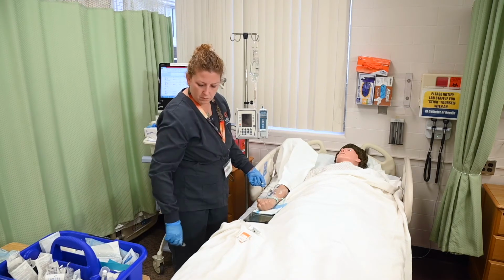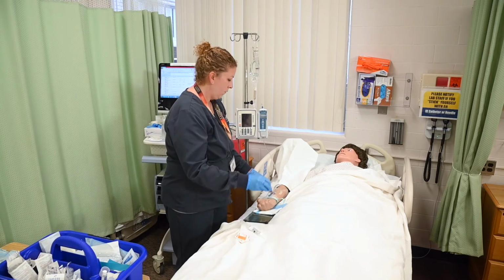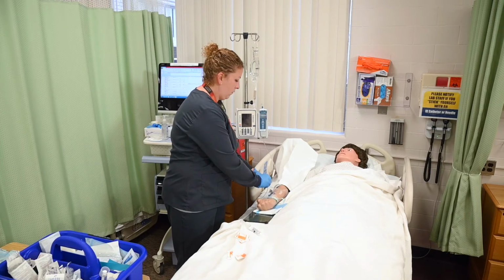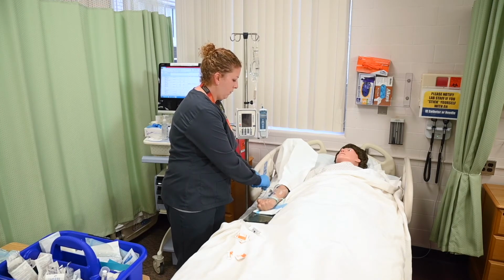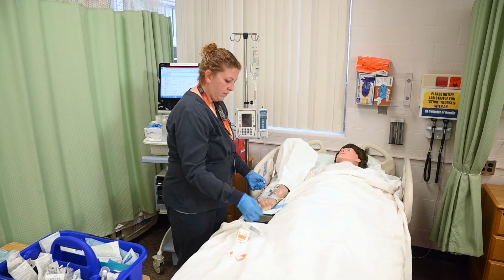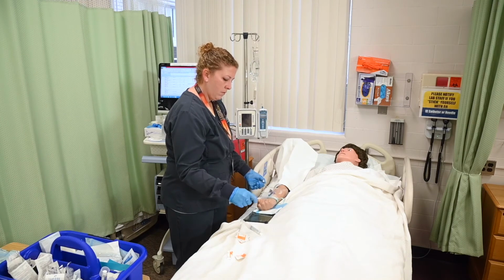Disconnect saline flush and cleanse the injection port with an alcohol prep pad by scrubbing for 15 seconds and allow to dry completely. Connect the medication syringe to the IV injection port.